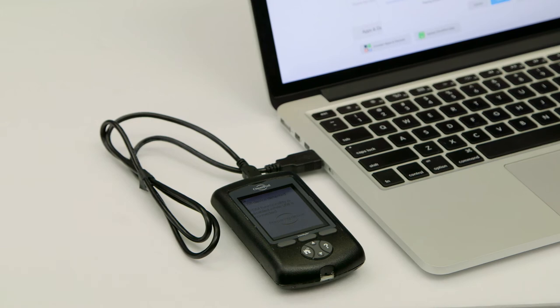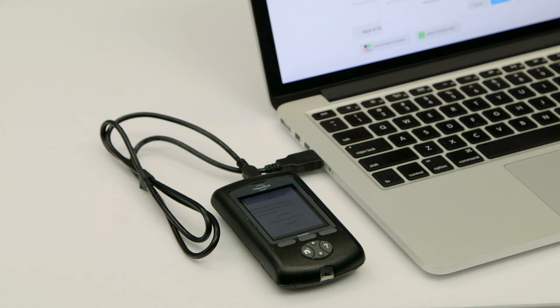You will hear a single beep. This will be followed by a set of four beeps. This indicates that the Omnipod is ready to upload.